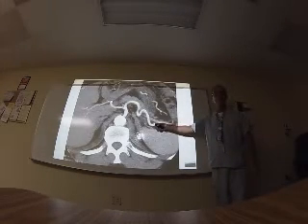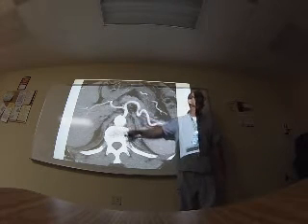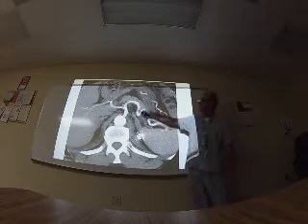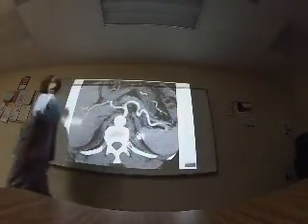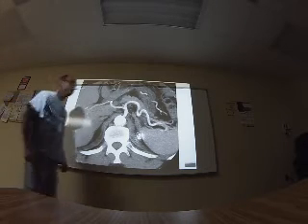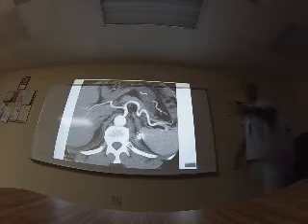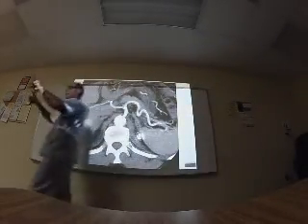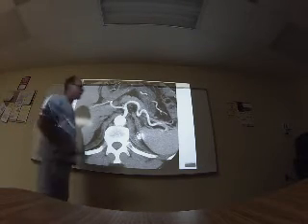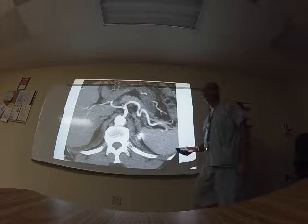Okay, this is not ultrasound, of course, because the artery is white. In ultrasound, the arteries have blood and are anechoic. This is a CT scan and you can see the splenic artery that has a lot of curves and the hepatic artery that goes to the liver. What is the principal vessel that gives blood to the liver? It's not the hepatic artery. The portal vein. The portal vein gives more blood than the hepatic artery. The blood of the hepatic artery mixes with the blood of the portal vein and goes through the liver. This is the hepatic artery. It's little, it's not as big as the portal vein.